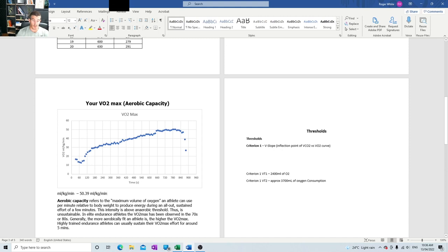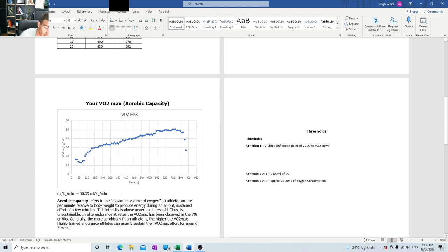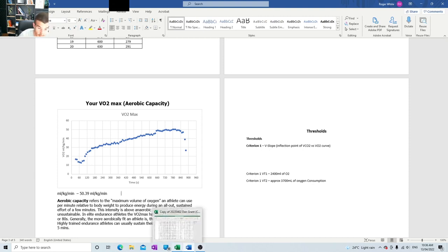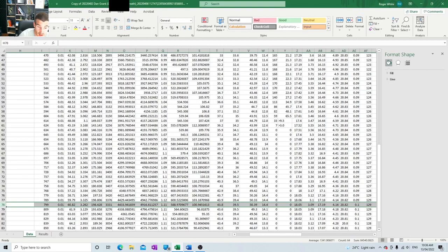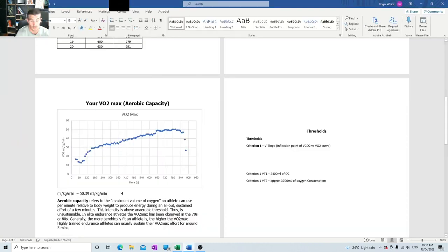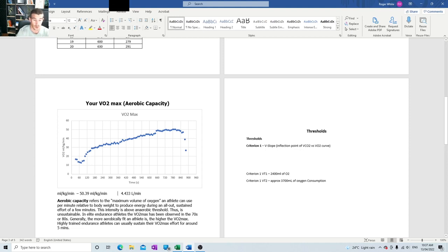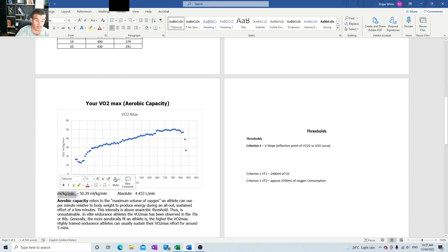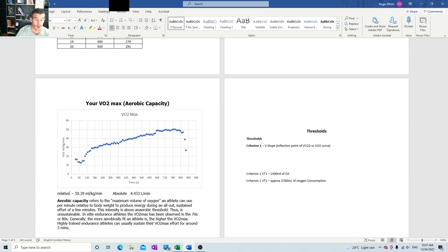And then it's also helpful. Some athletes are big. So their oxygen consumption, say you're measuring a rower rather than a cyclist, it can be kind of disheartening for them to see their relative score with VO2 max because they're so big and it gets divided by their body weight. It can be a better representation for these kinds of athletes to show the absolute score. So the absolute score was 4.433 liters of oxygen. So 4.433 liters per minute. So that's referred to as the absolute. And this is the relative. So they're VO2 max results.